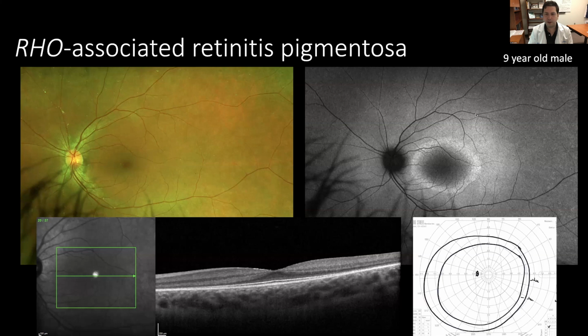When they go into a dark theater, for example, or into a dark room, it takes them longer than their friends to adapt to those dark situations. They haven't had any problems with their visual acuity. They have very strong vision, 20/20 vision. And when we look at their retina in the color photo in the top left, it has a fairly bland and normal appearance. The optic nerve has a good color, and the vessels have good integrity. The macula and the fovea have a normal pigmentation.